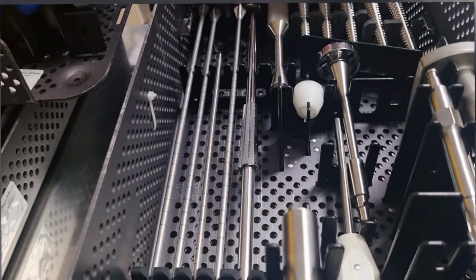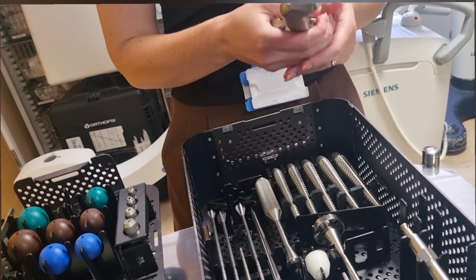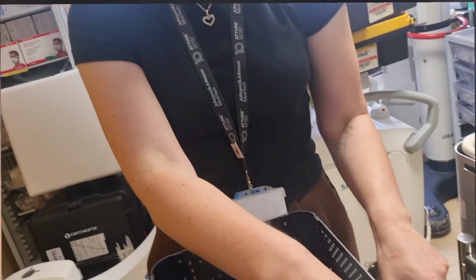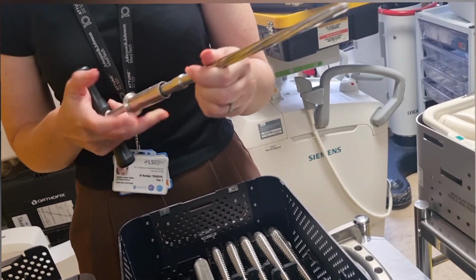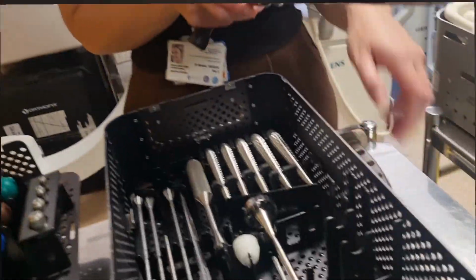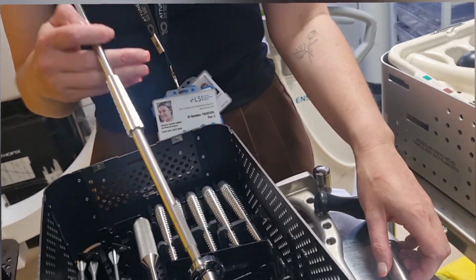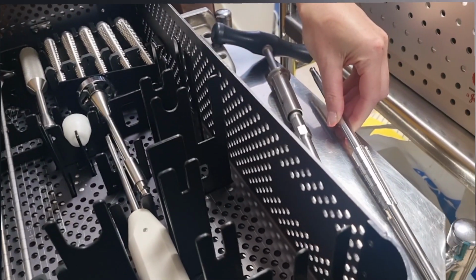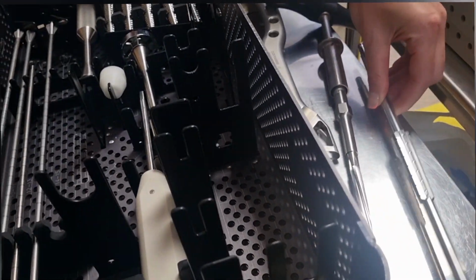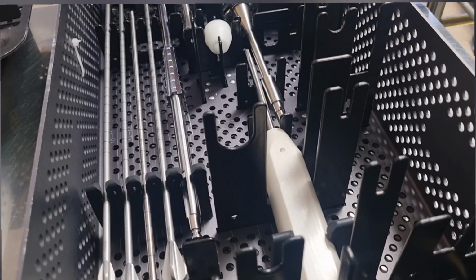So when you do a stem, you've got your box osteotome, which goes on that handle there. That would be the first thing they use. And then you've got your T-handle starter reamer. And then this is optional. They don't have to use it, but it's called a lateralizer, and you can put it on power and just use it to open up the canal. So it'd be step 3 if you were going to use it. And then otherwise from there you'll just go straight to your broaches.